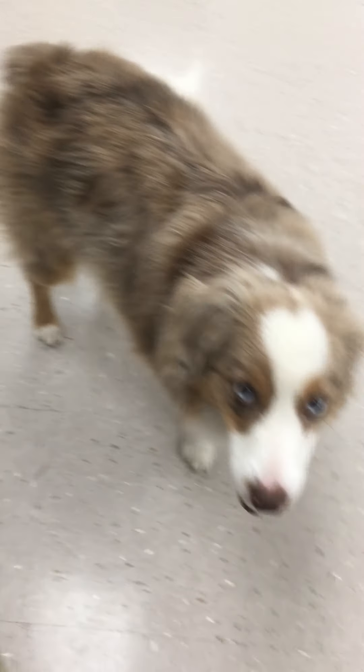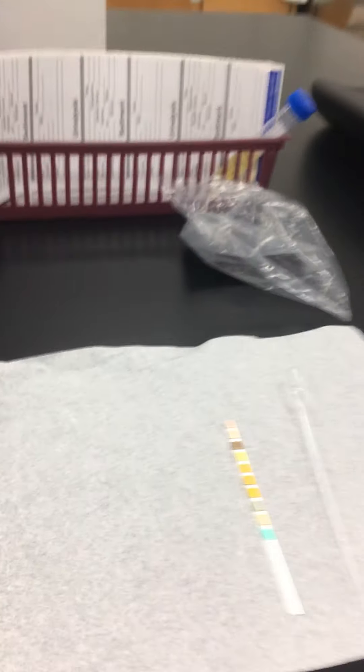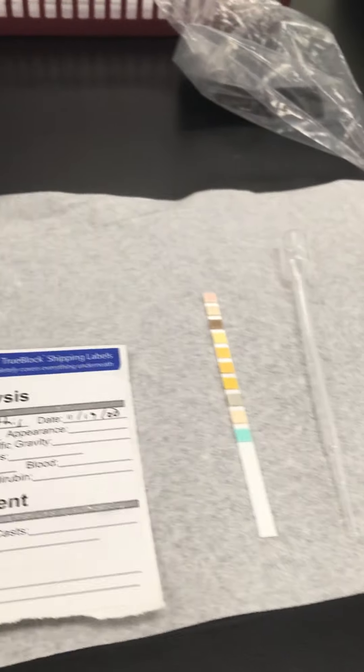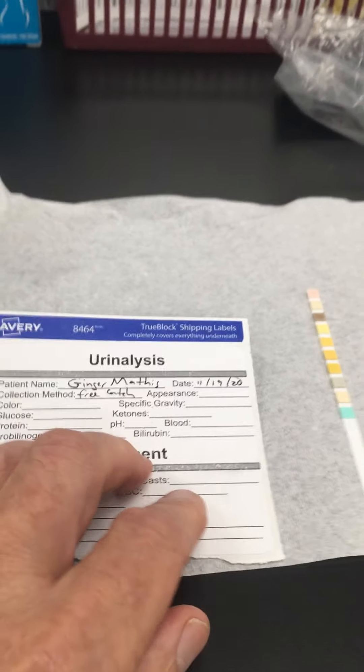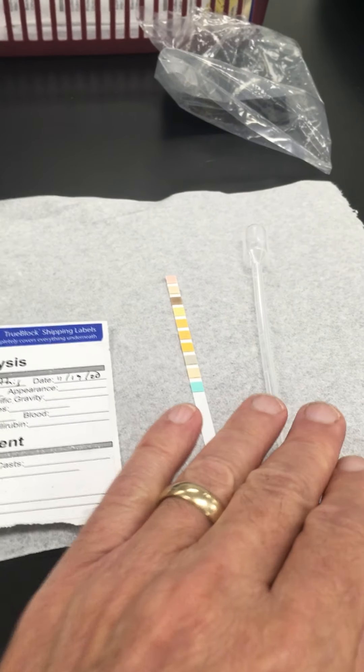Hi everyone. Ginger and I were hoping to show you how to do your at-home urinalysis. These are some of the things you should have in your kit. You've got your form, your chemical reagent strip, and a pipette.